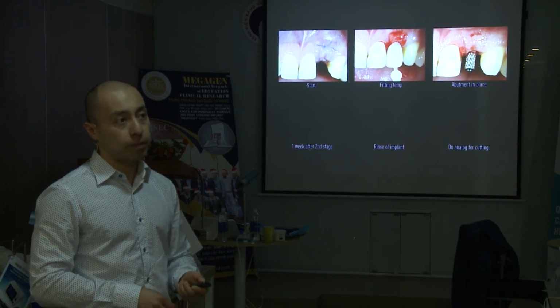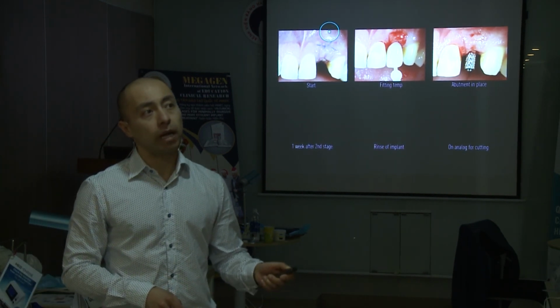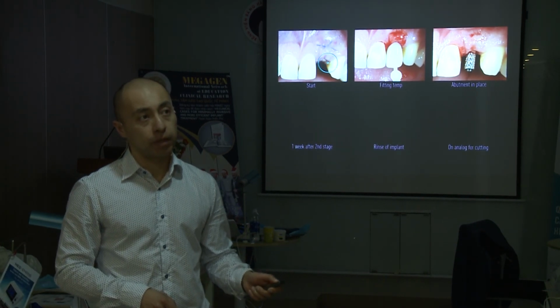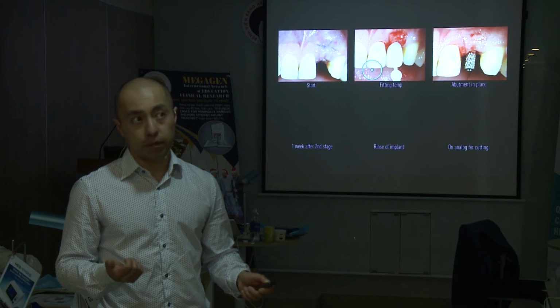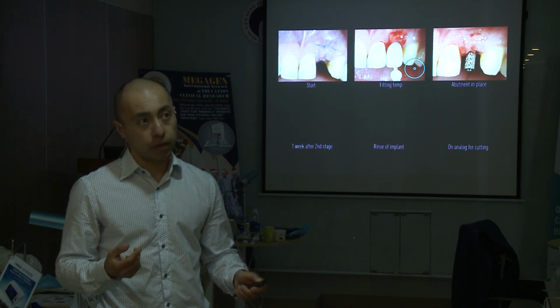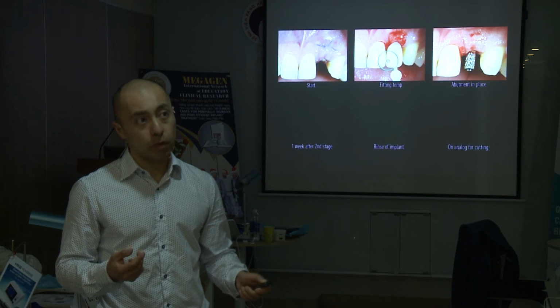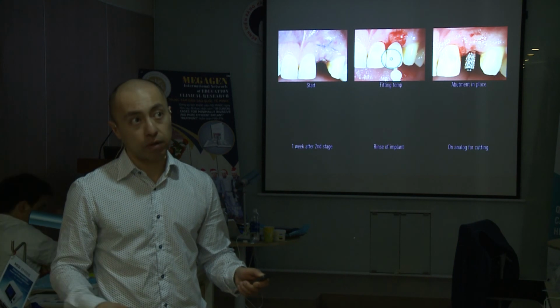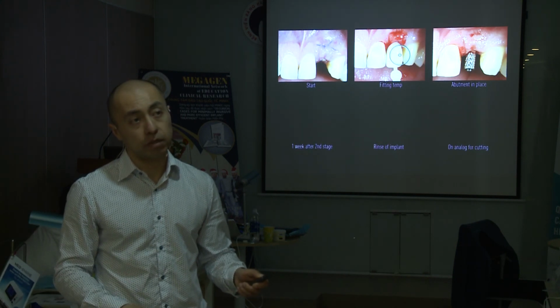So this is already patient 2-1, I've done already the implant, and this is at second stage surgery. You can do a putty, you can use a splint over it, or you can use temporary crown, which I have in my box, so I tried it in, I said, okay, this is the correct phase.